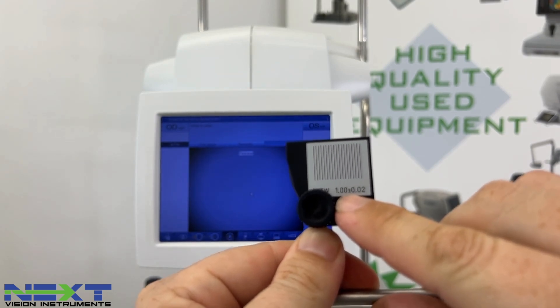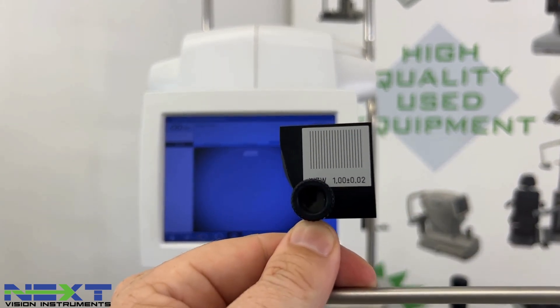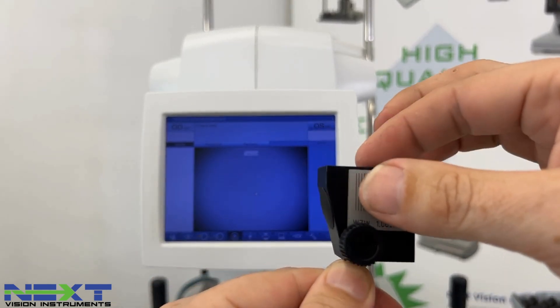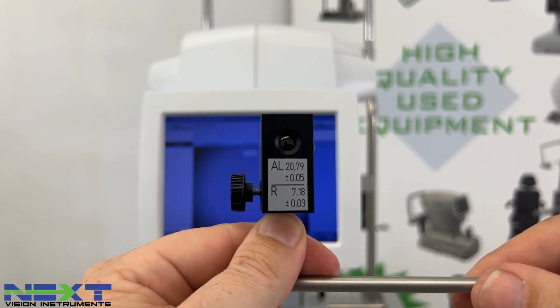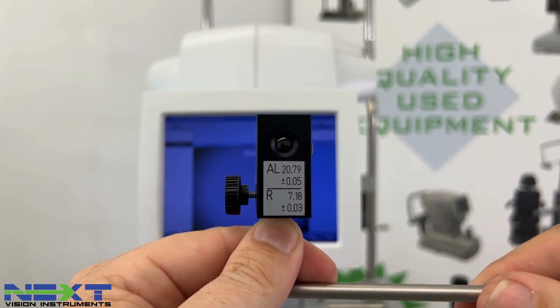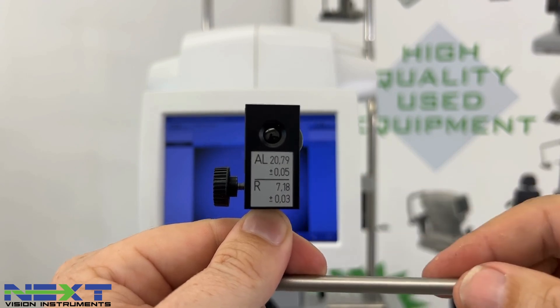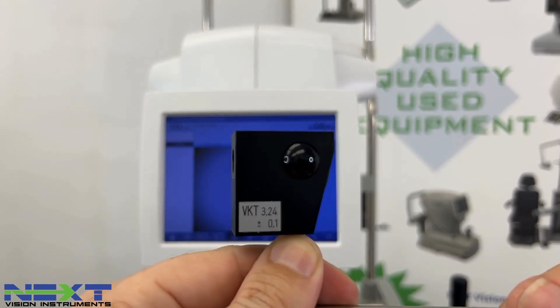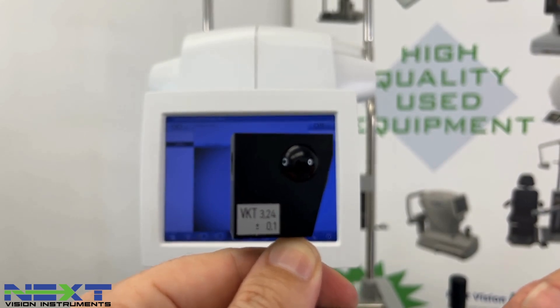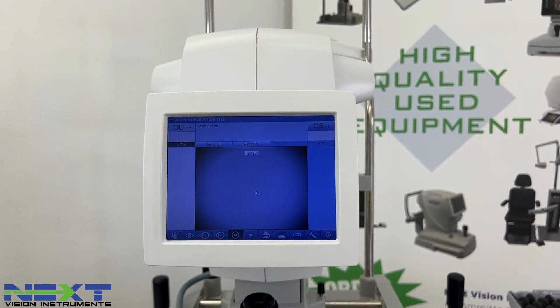The white-to-white calibration value reads 1.01 millimeters. On the test eye itself, it's supposed to be 1.00 with a plus or minus tolerance of 0.02, so we're within tolerance. The axial length on this test eye is supposed to be 20.79 millimeters with a plus or minus tolerance of 0.05. The same applies to the K's. For the anterior chamber depth, it should be 3.24 with a plus or minus tolerance of 0.1. Once all your values are within range, you're good to go for the day and can measure your first patient.